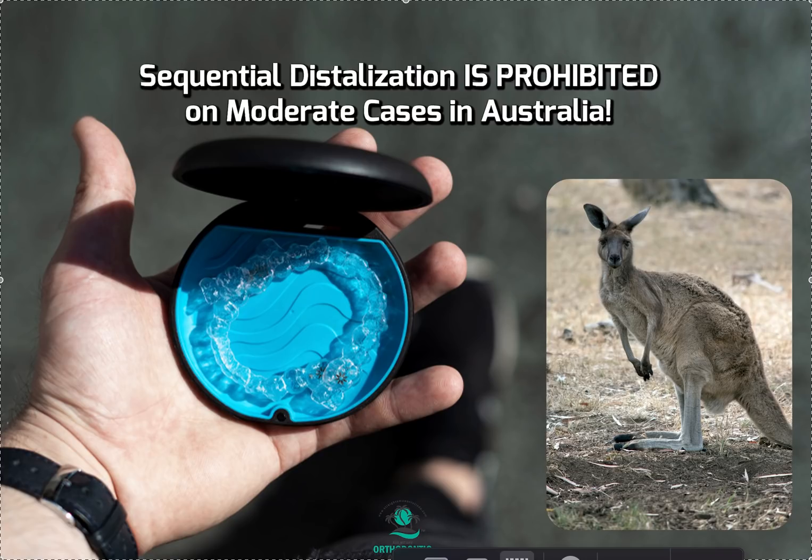But in any case, for me, I knew that there are restrictions on Express. There's a lot of stuff I can't use, features like bite turbos and elastics, and that's fine. I really wouldn't expect to do that in 10 aligners. Anyways, for a while, Light had restrictions. I don't think you can use elastics, which is fine. It wouldn't make sense to use elastics in 14 aligners anyways. But I know you can use bite turbos, so that I haven't had a problem with.